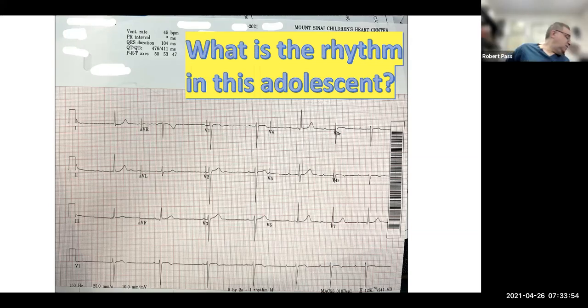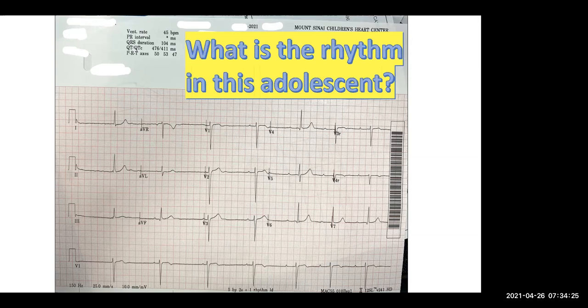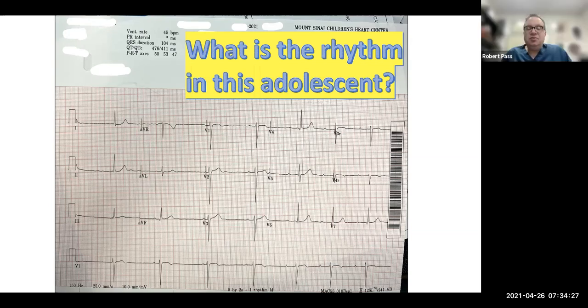Right, so you're doing a Holter because you want to see. So right now we see two electrophysiological abnormalities. The first is that the patient is bradycardic and has sinus node dysfunction. And the second is that there is first-degree heart block. And we don't understand why either of those facts are in this patient. And so you would want to do a Holter because you would want to see what happens to the sinus node when a patient exercises.